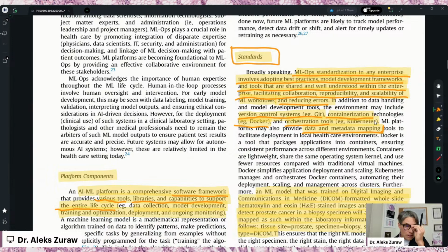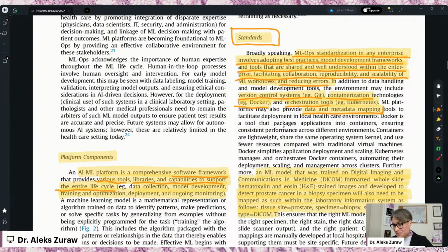A version control system is something that controls versions, right? You had a version 1 that did one thing, and then you improved something. It has to be version 2, next version, next version. And people who develop software know that. People who work in a regulated environment with software know that version control and also audit trail, so trailing all the accesses, times of access to the software, are features that need to be included in these platforms.